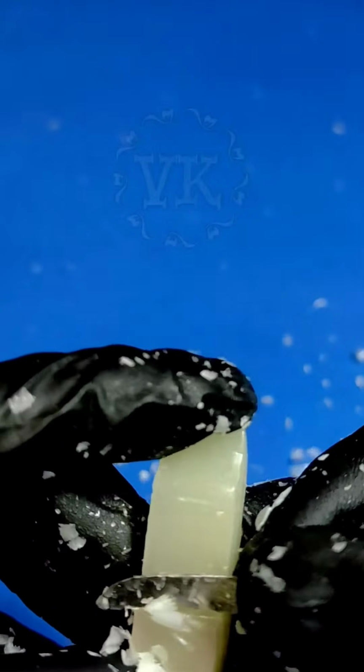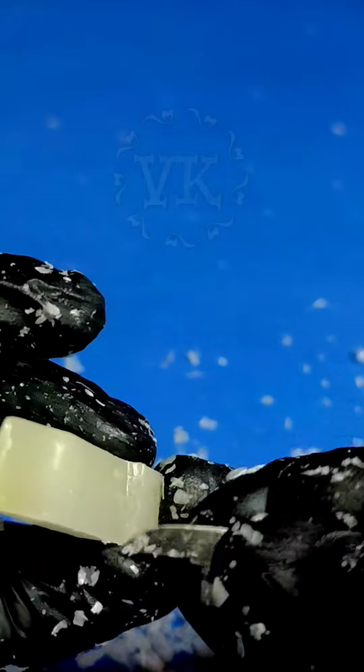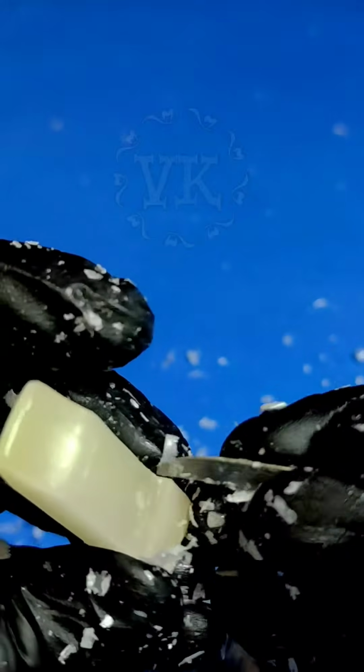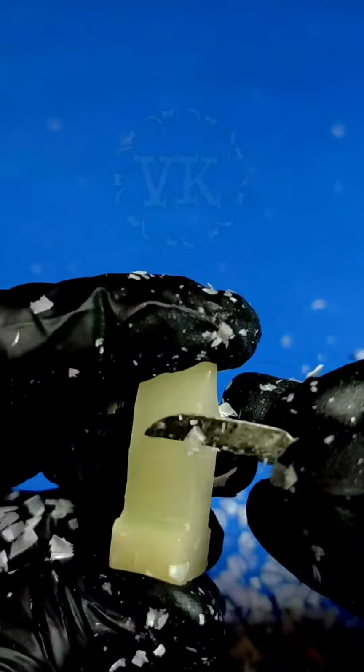Perfectly remove all the wax outside the boundaries. Like that. And that.